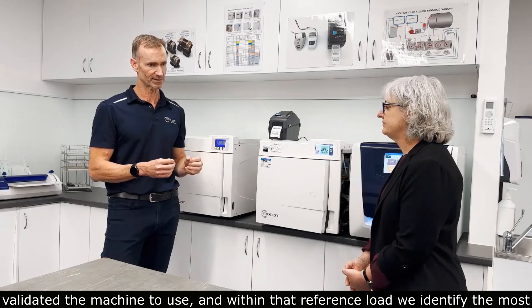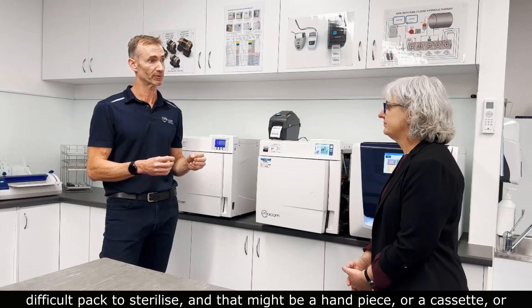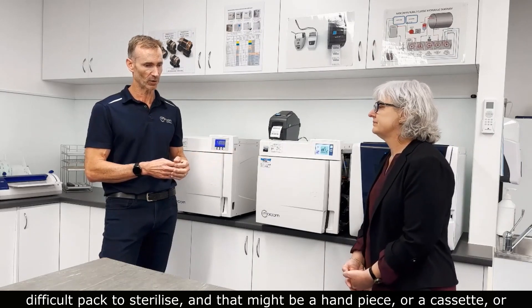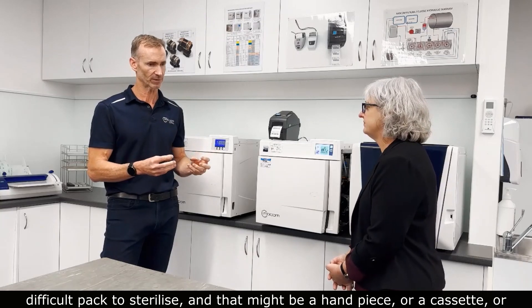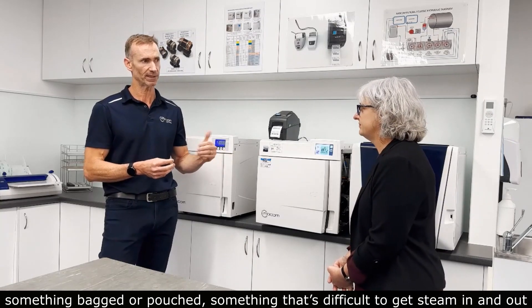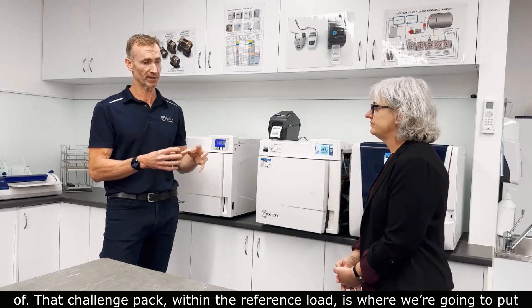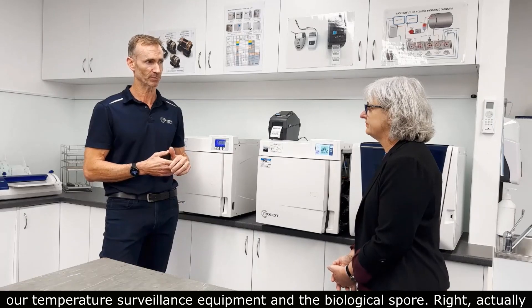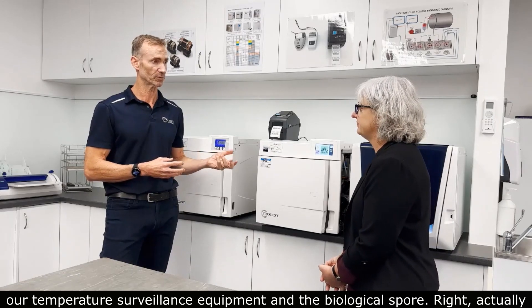Within that reference load, we identify the most difficult pack to sterilise — that might be a handpiece, a cassette, or something bagged or pouched — something that's difficult to get steam in and out of. That challenge pack within the reference load is where we're going to place our temperature surveillance equipment and the biological spore.